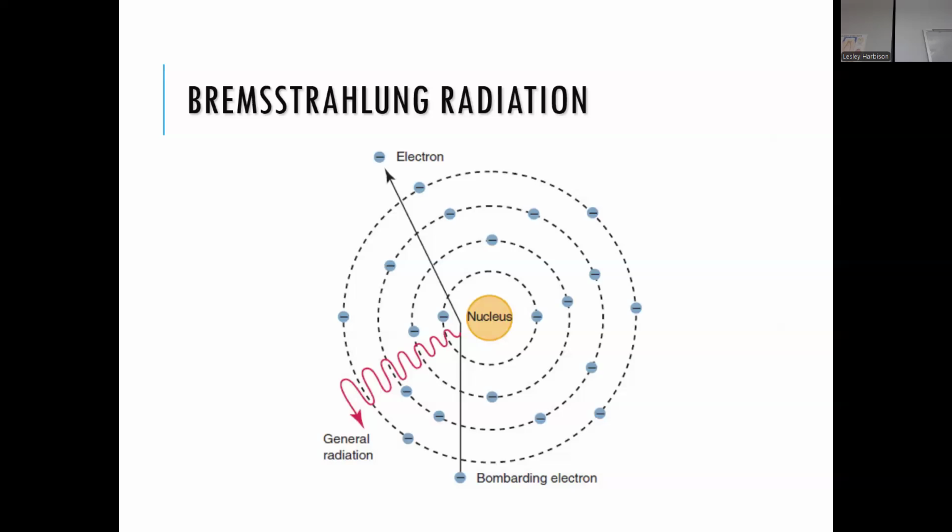Now, it could do that in a number of different ways. It could actually move in different areas of the atom. When that happens, some might be really strong X-rays, really strong, good, useful X-rays. It might do that same motion where it veers off, but in a different part in an outer ring, and then it's going to put off a weaker X-ray.